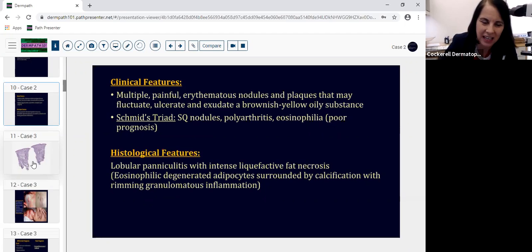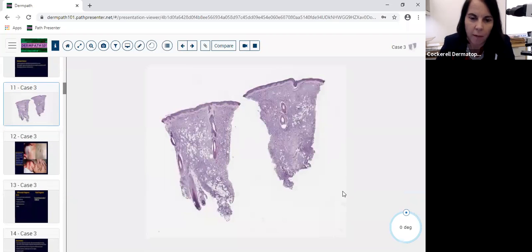Nothing really can do that, not even trauma, with those basophilic areas. But as the lesion gets older, the basophilic areas disappear, and it does get harder in the older lesions that become more eosinophilic. So it gets trickier when the lesions get older. But typically this is acute pancreatitis, so it's a very fast phenomenon. This is a very gorgeous punch biopsy.